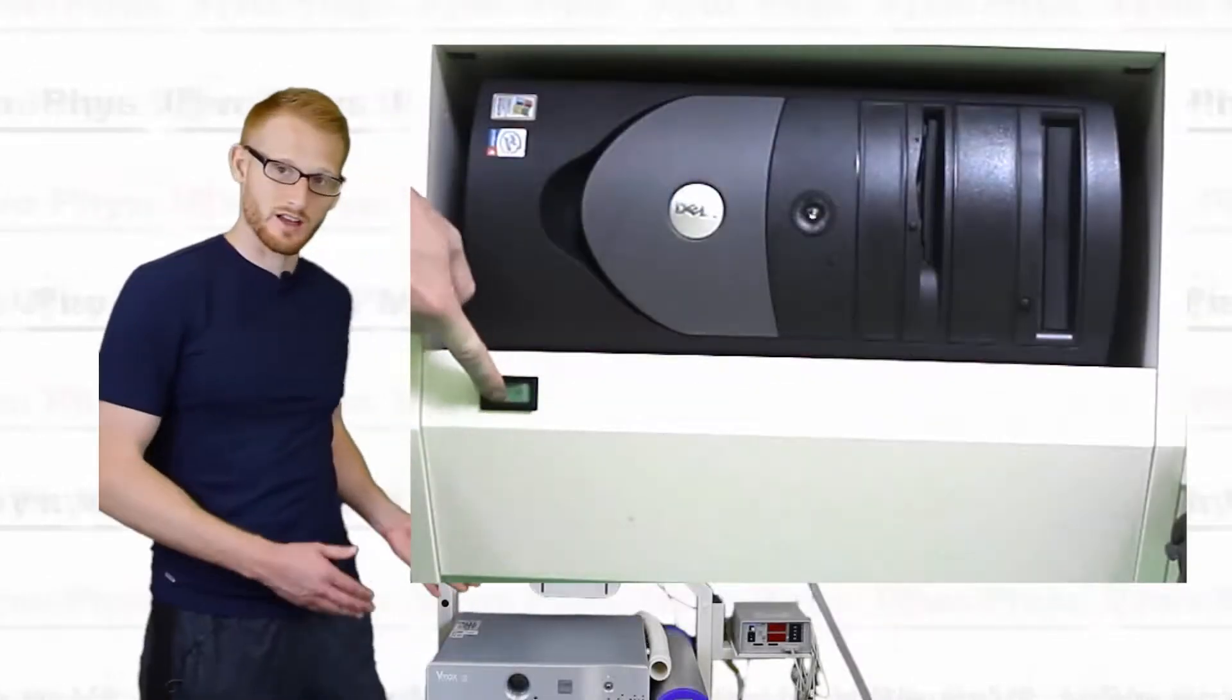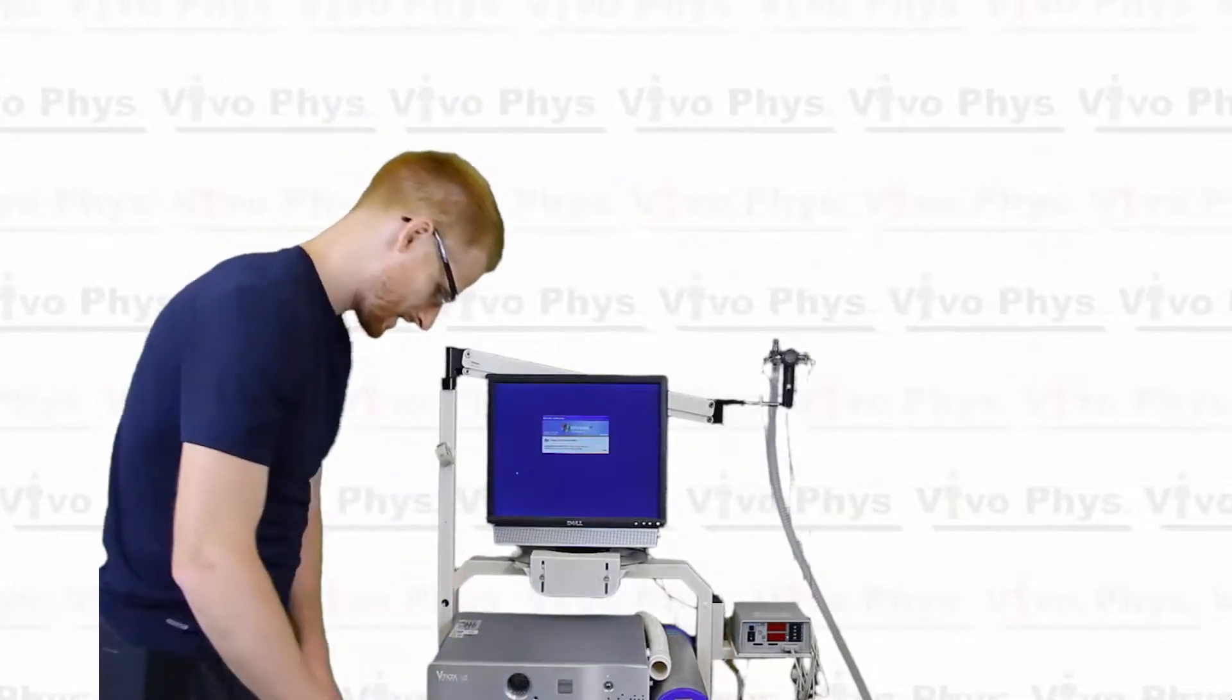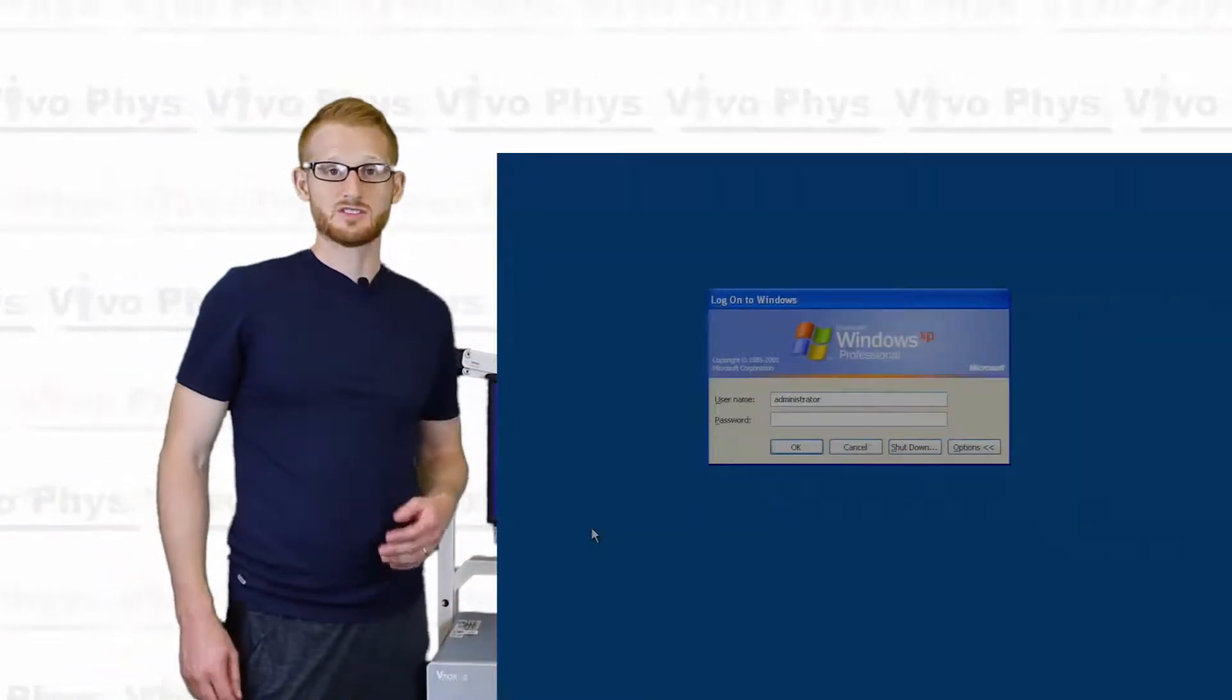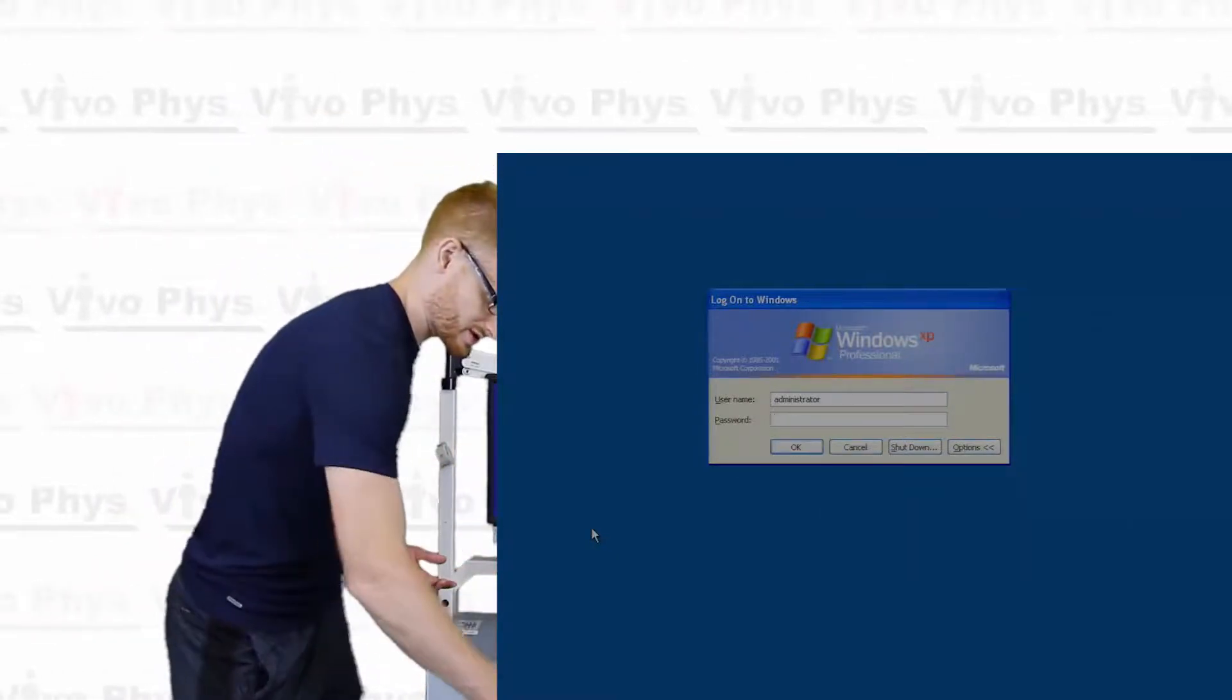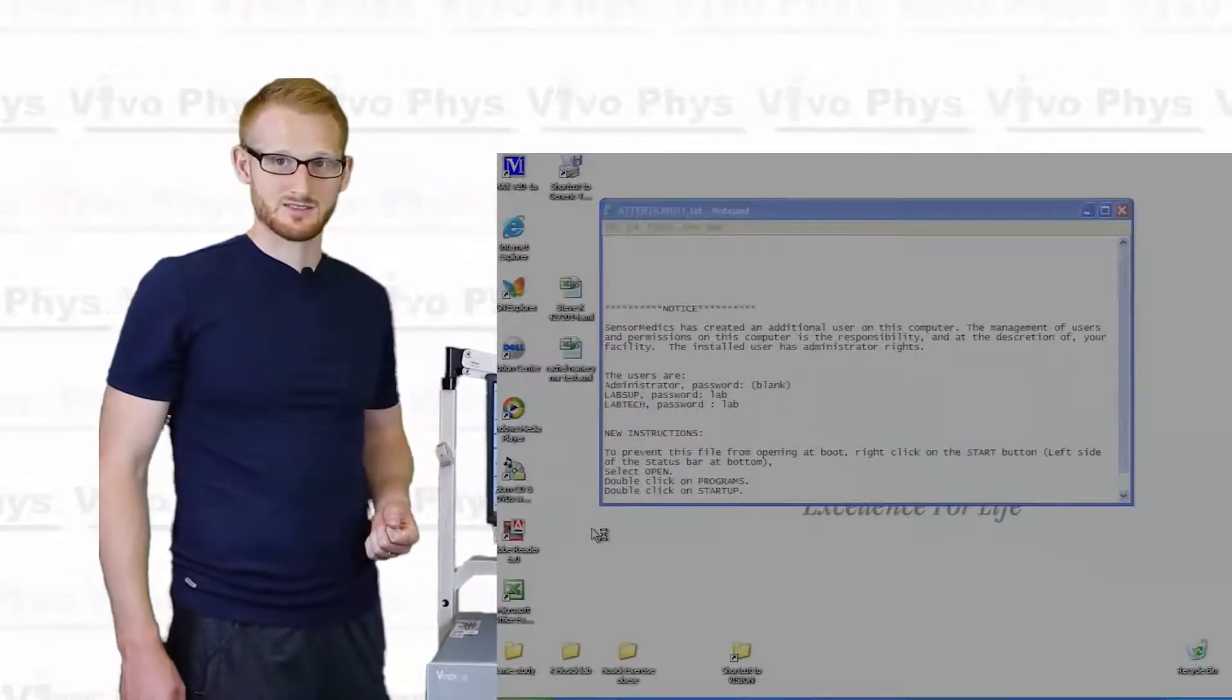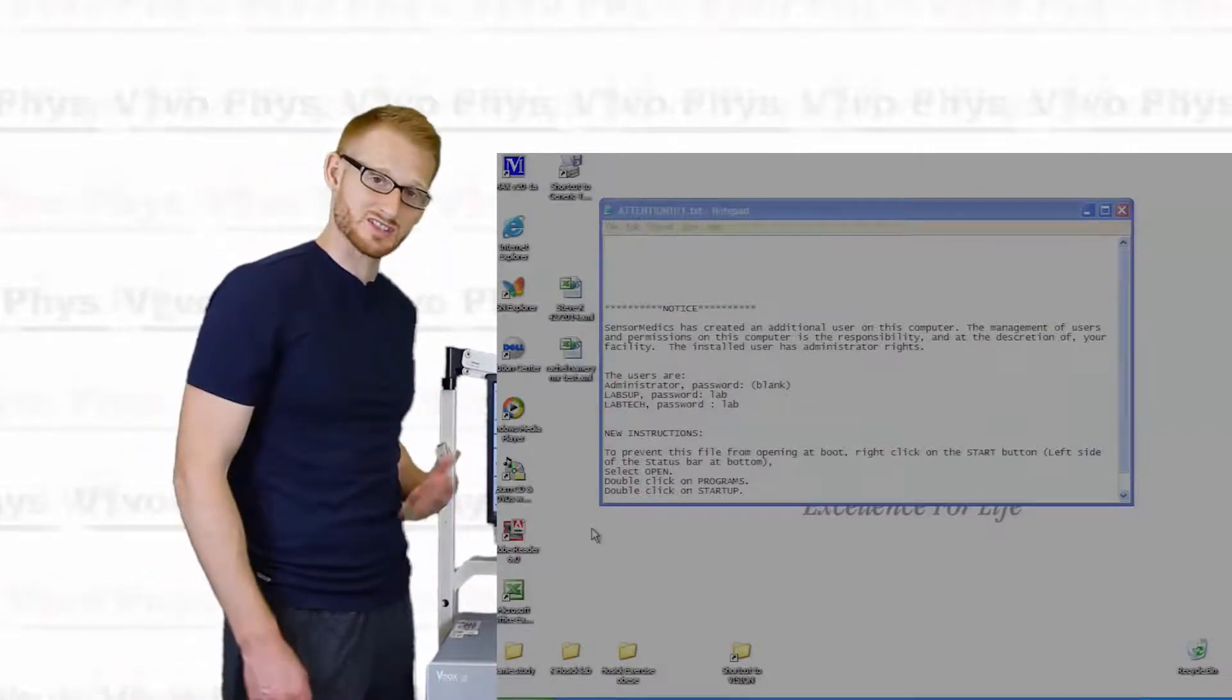So first off, I've already turned on the system, and now it's asking us to press Control-Alt-Delete in order to get to the administrator password. This particular system does not have an administrator password, so all you have to do is hit Enter. And from there, you're going to see the Viasis screen come up. There's always going to be this attention, this warning sign that comes up. You can just exit out of that.